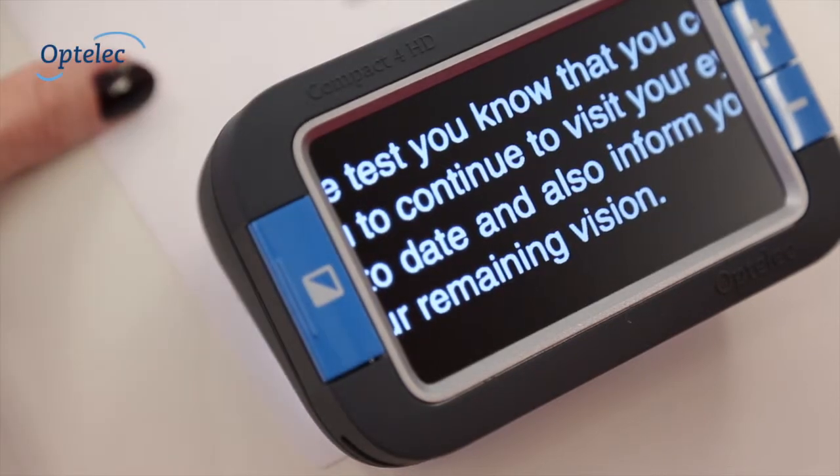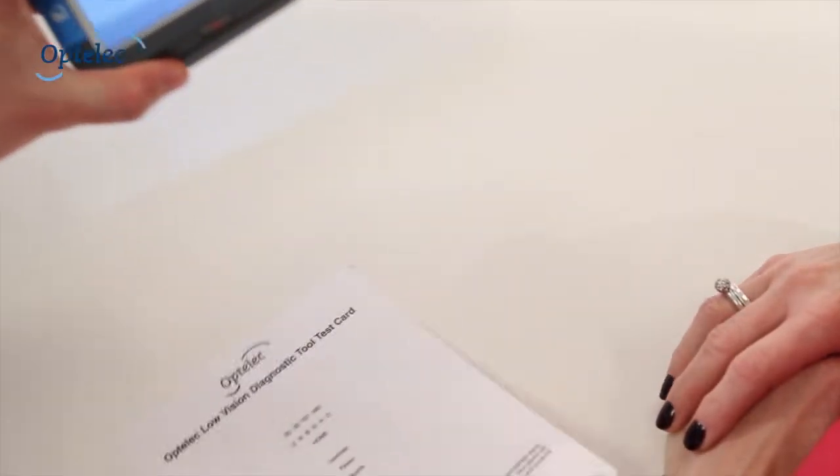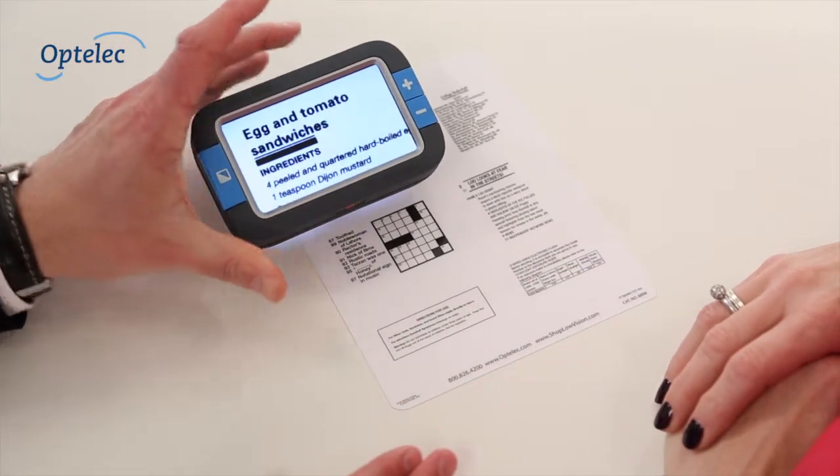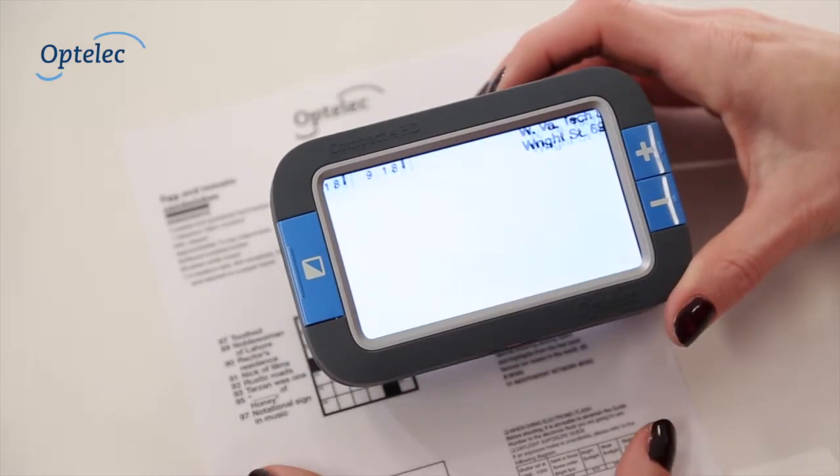Continue the evaluation by utilizing the back side of the chart, where you have more commonly used reading examples such as a newspaper column, TV guide, and a phone book.